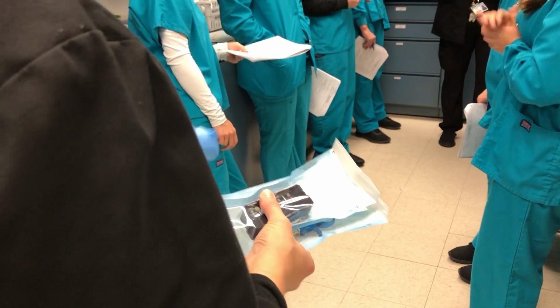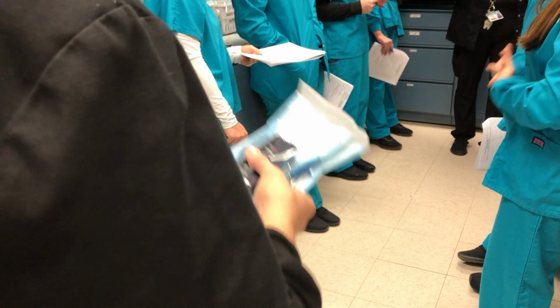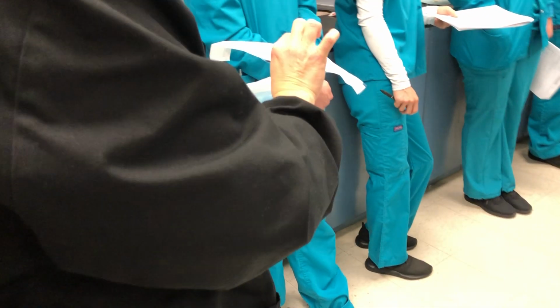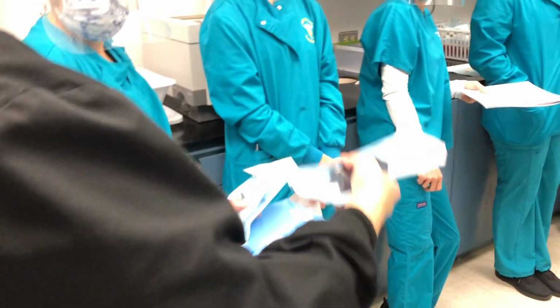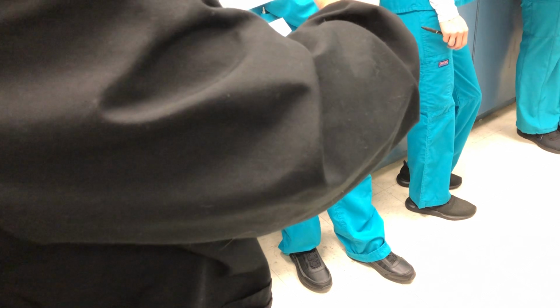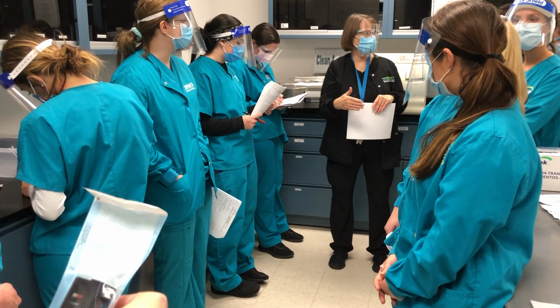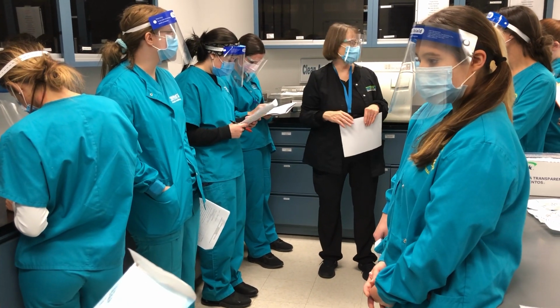And then the bags, do you see how one side is paper? This side looks more like white paper. And then the other side is like a clear plastic. The paper side has to be up. It's the way the autoclave steam circulates so that it gets into the bag correctly, and as long as the autoclave is working, then it is also sterilized.